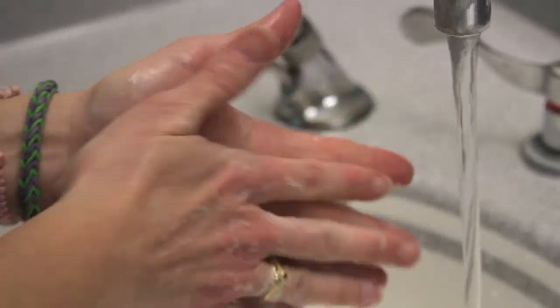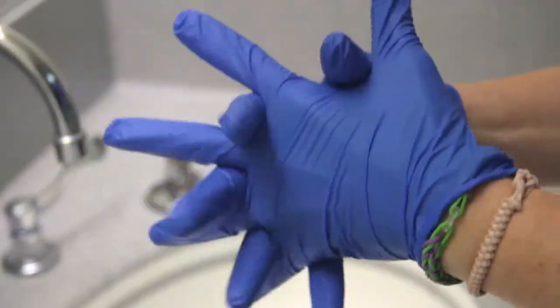Welcome to Reconstitution Review, where we'll go over how to reconstitute with various infusion devices. With all factor reconstitution, it's important to let the factor get to room temperature. While you're waiting, wash your hands. When they're dry, put on your gloves to get started.